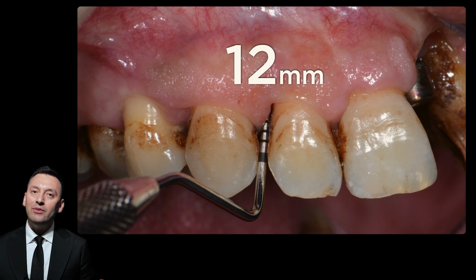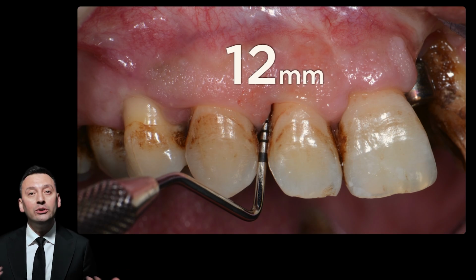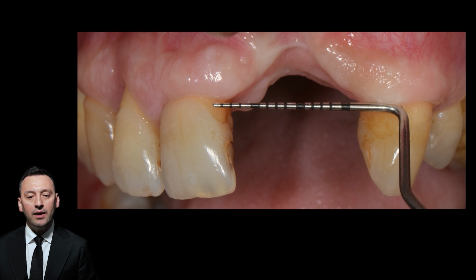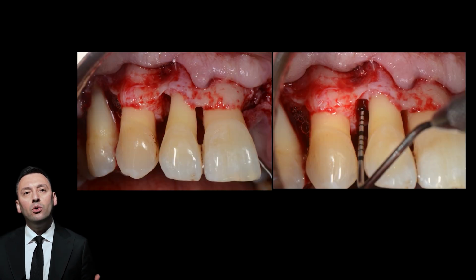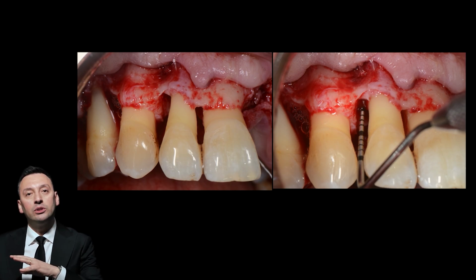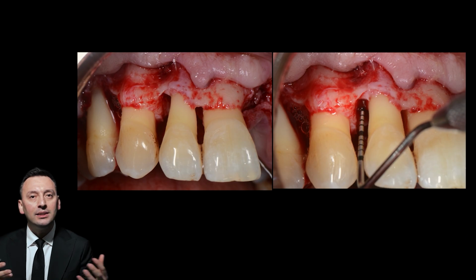In this case, when we took the anamnesis, he smoked 2 packs of cigarettes. First, if you're going to treat these types of cases, you should adjust and modify the conditions of the patient, of course. And he stopped smoking. After this, he lost, of course, the remaining laterals. I applied step 1 and 2 periodontal therapy, and we ended up with this huge vertical hard and soft tissue defect. Now we are going to discuss, should we close the pocket first and then apply the vertical GBR, or should we perform it simultaneously?